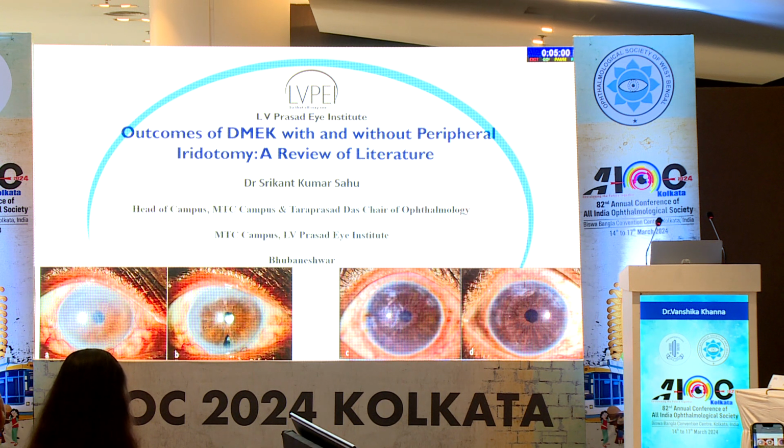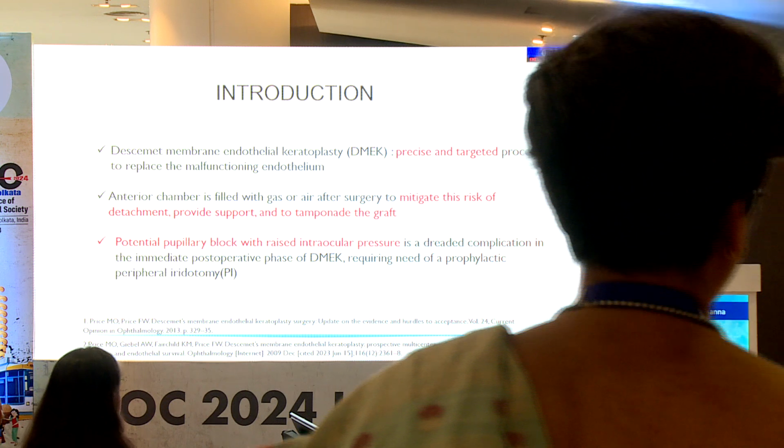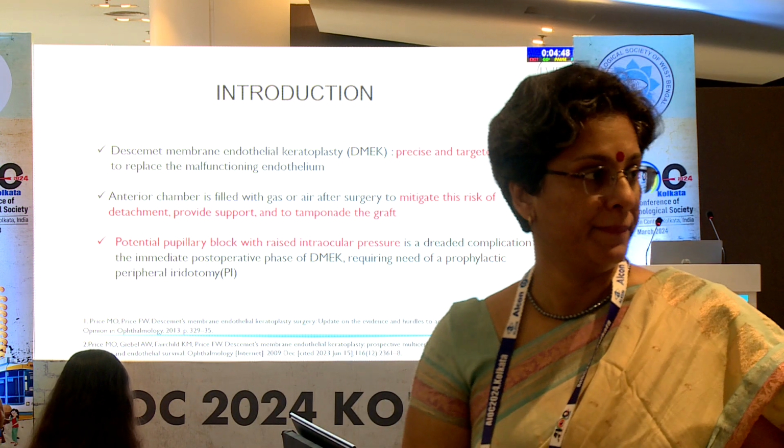Today I will be talking about outcomes of DMEK with and without PI. You see the picture of PI here on the left and without PI on the right. DMEK, as you know, is a very precise and targeted procedure to replace the malfunctioning endothelium.